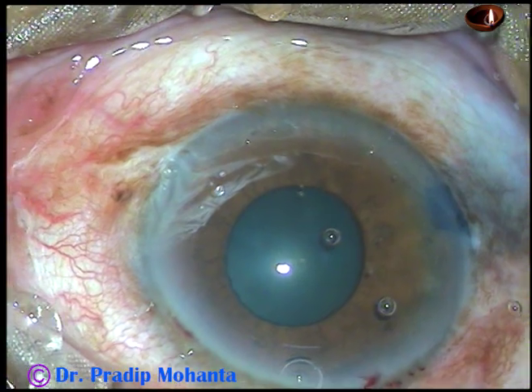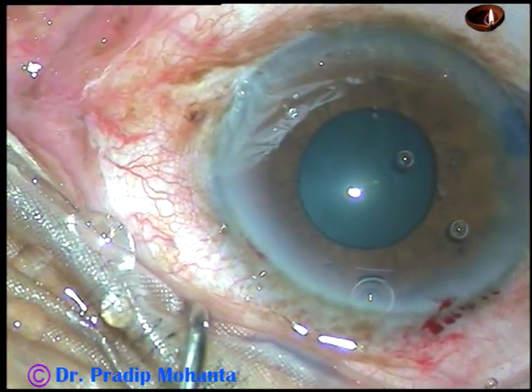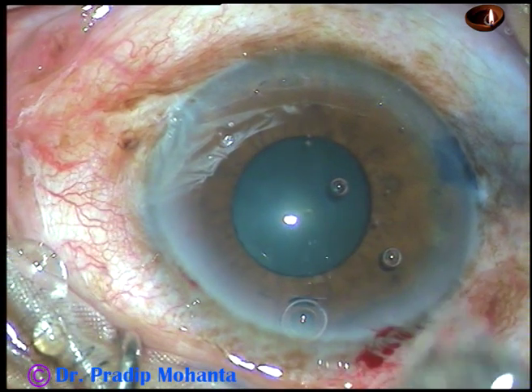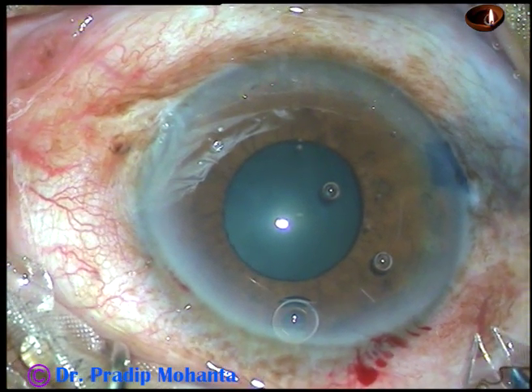B-hex is a very nice hexagonal pupil expander invented by Dr. Suven Bhattacharjee of India. Here it is — it comes in a nice housing.